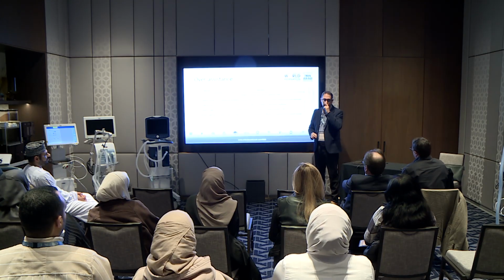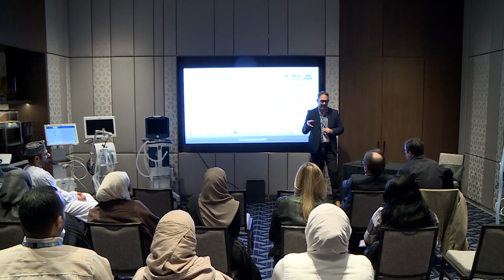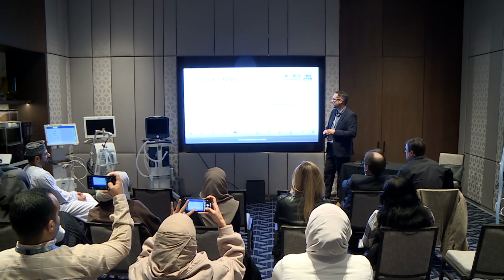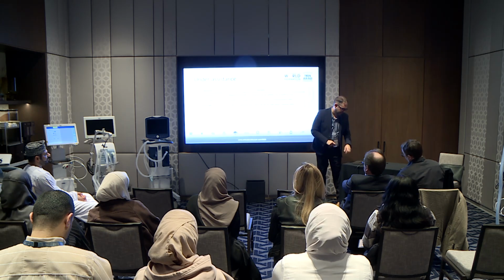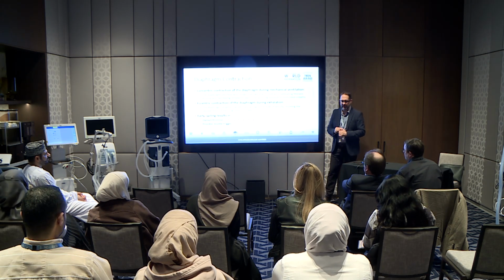And then reverse triggering: the patient's inspiratory effort occurs after mechanical insufflation in a repetitive and consistent manner. Usually when you see reverse triggering, it's in a ratio like 1 to 1 or 1 to 2, and it's very rhythmic. For under assistance, the inspiratory effort is unsupported by the ventilator due to insufficient flow. Early cycling: the pressurization is shorter than the duration of the patient's effort. And then double triggering: 2 pressurized breaths.